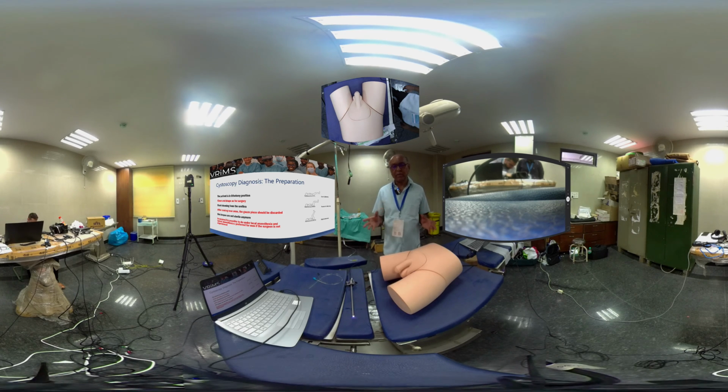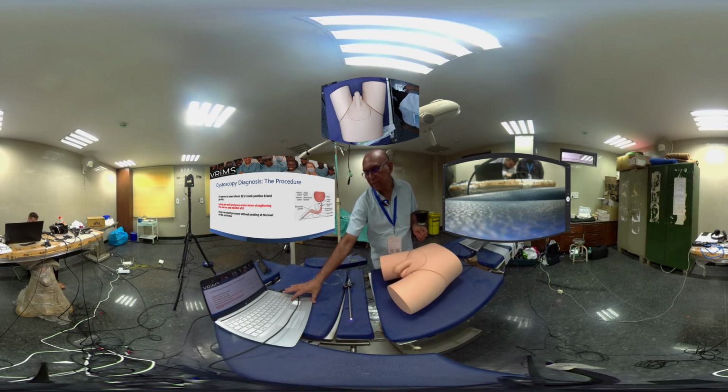And then in men or women, generally it is preferable to do it in a lithotomy position and clean and drape as for regular conventional surgery, because it is a sterile procedure. The scopes can be sterilized using glutaraldehyde or Cidex, and here in this scope also there is a portion which can be comfortably immersed in Cidex. This is a wire, and it is covered with a waterproof coating, so you can immerse and sterilize it in the Cidex.